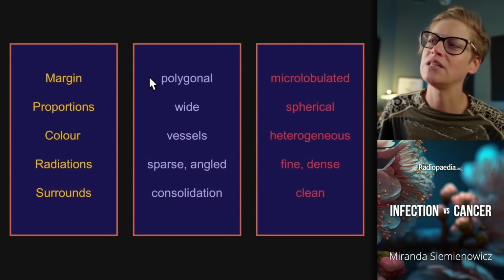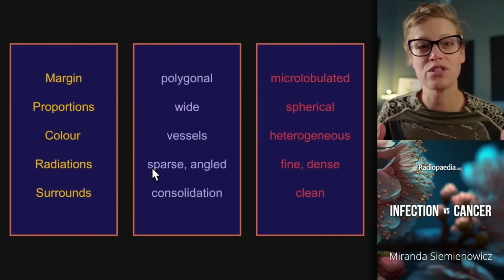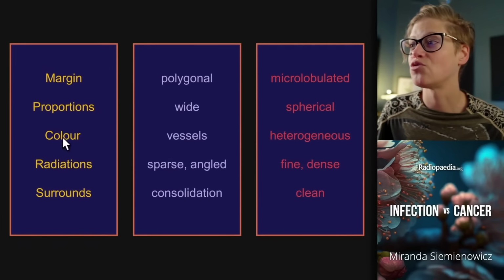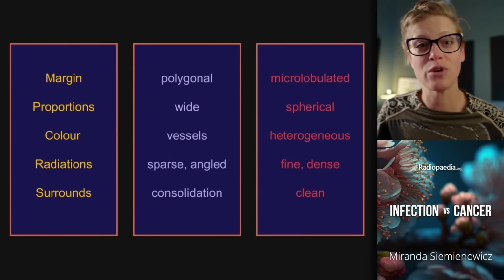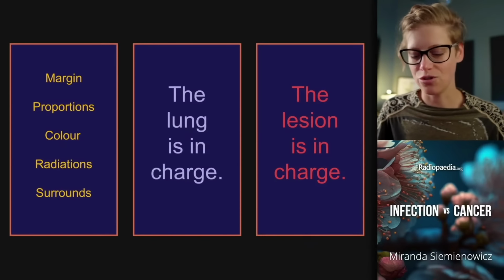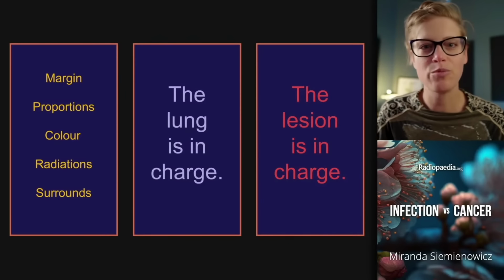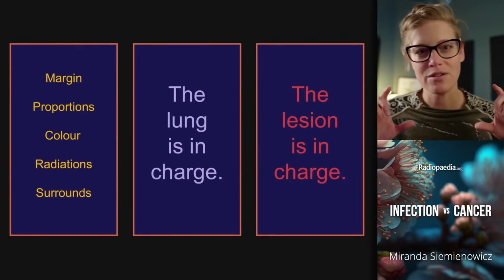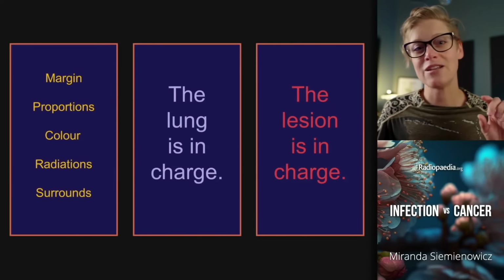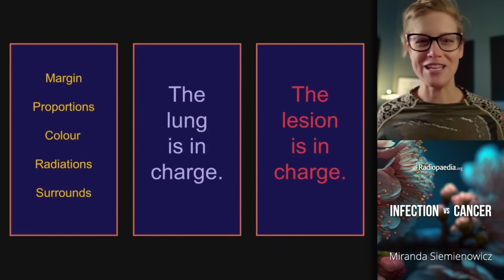We've looked at how in any one lesion, multiple different features come together to improve your diagnostic confidence, and how you interpret all of these features as a constellation, because drawing all of these together is what allows you to interpret this fundamental question of who is in charge. And this allows you to create an environment where the patient becomes appropriately counseled as to their genuine risk of malignancy, an appropriate workup algorithm is pursued, there is minimization of unnecessary biopsy, and overall, fundamentally, an opportunity for you to communicate specifically and accurately with your referrer, which is what we're here to do.